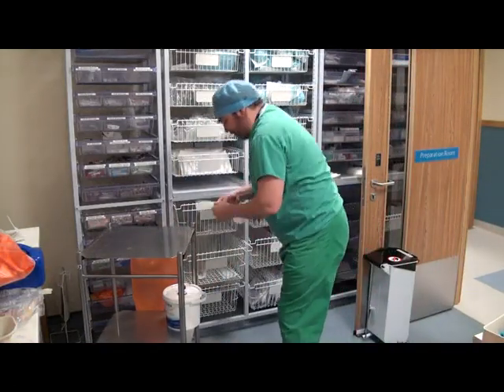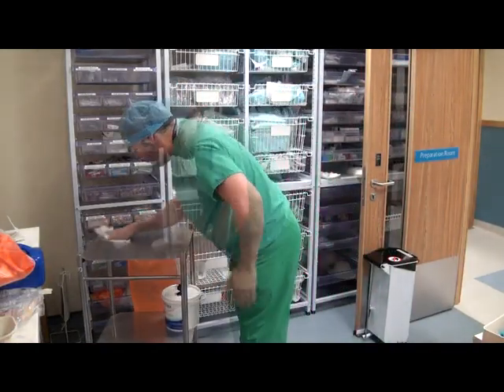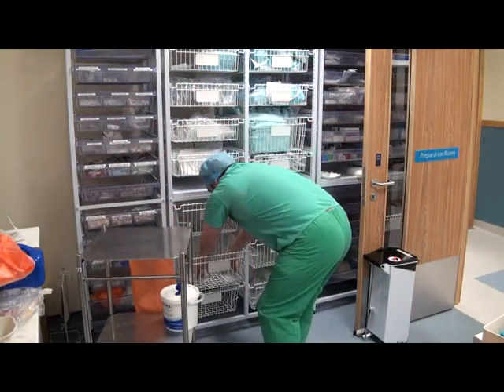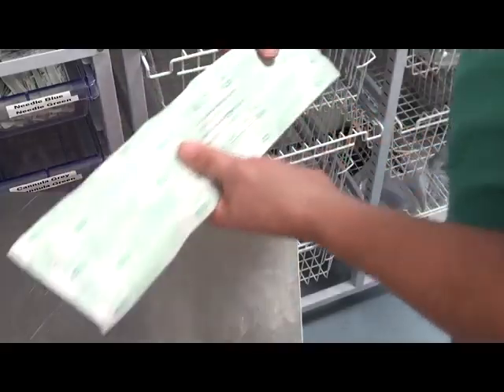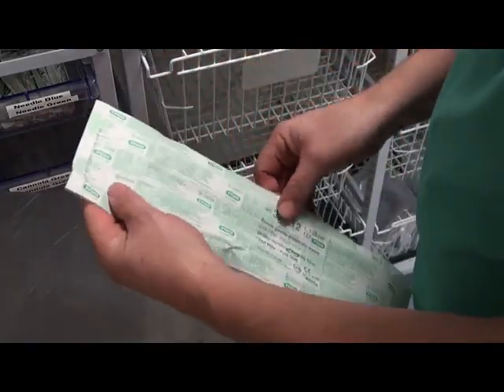After washing hands, prepare a dressing trolley and ensure all surfaces are clinically clean. Assemble all the necessary equipment for NG tube insertion, checking packaging and expiry dates.